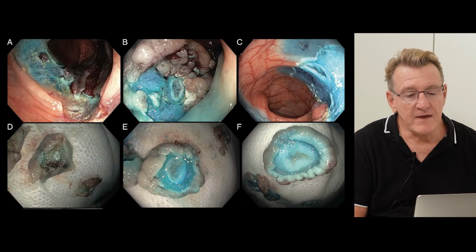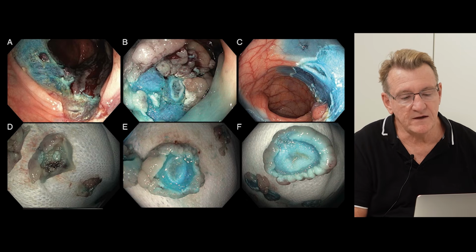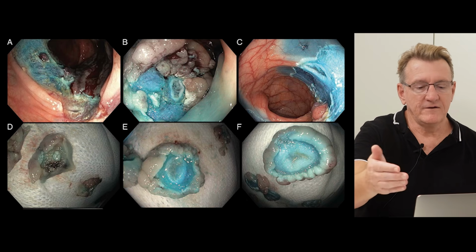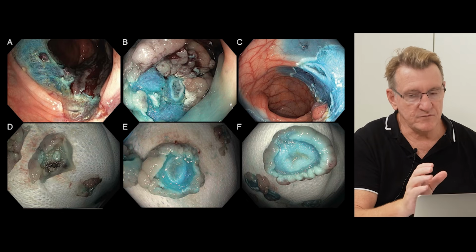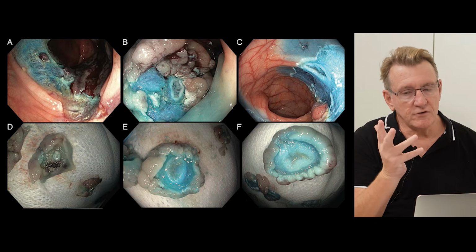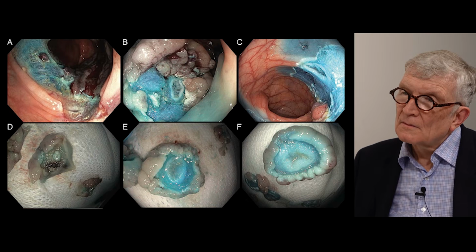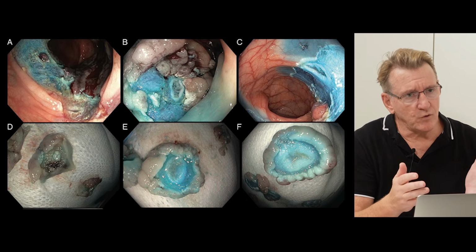And the other way you can be sure about what you've done: this is the defect target, and this is the specimen target. So intraluminally, the clue to the fact that you may have created a type 3 is slow transection. You close the snare, we check mobility, it seems fine, and then as you cut through, there's a stalling in the transection.